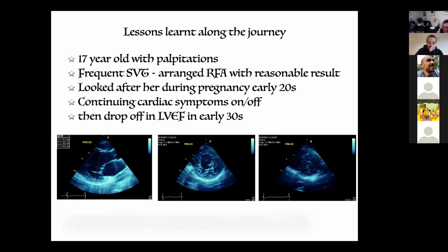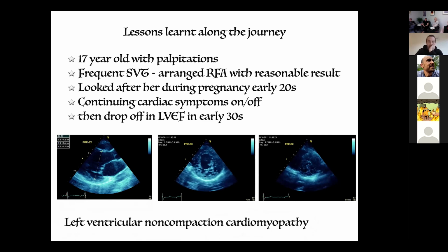Yeah, it's that kind of apical view. It looks very worrisome. It looks very abnormal, that tissue. You obviously can't see it in your parasternal long axis, which doesn't play, but that's the second loop that is playing, and even further down on the third loop that's now playing, that's grossly abnormal myocardium. Given the early onset of symptoms in a younger patient and that very peculiar appearance of the myocardium, it's that thing. As I understand it, non-compaction is exceptionally rare, except when you're sitting an echo exam, when it's almost always prevalent.